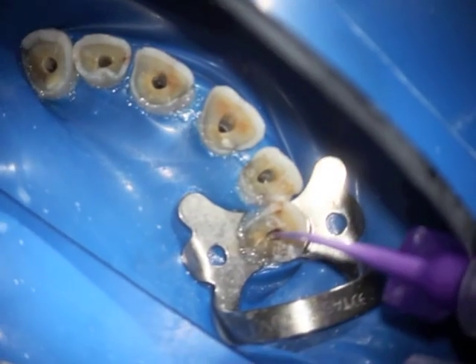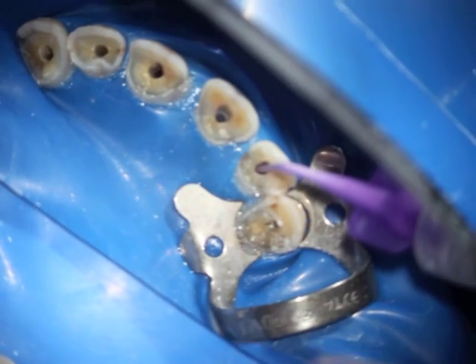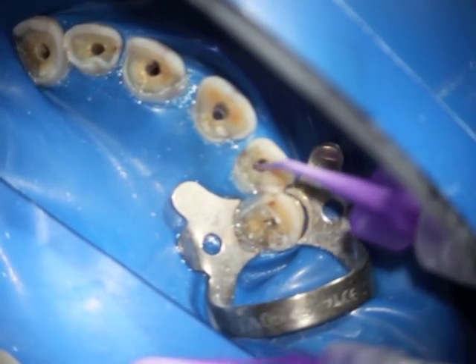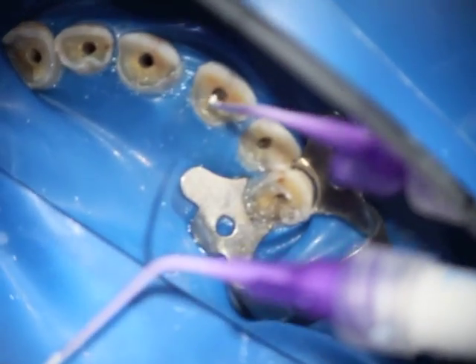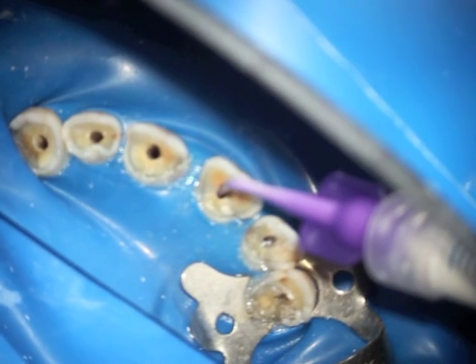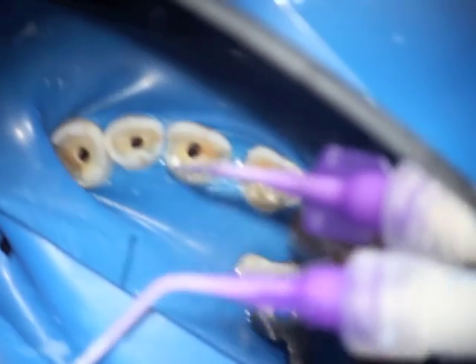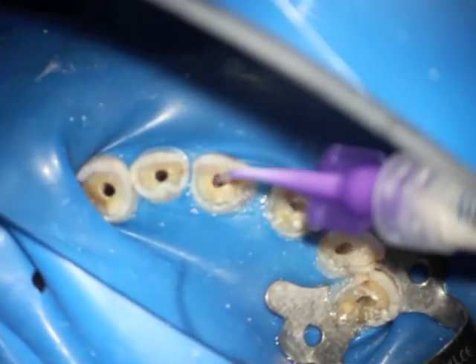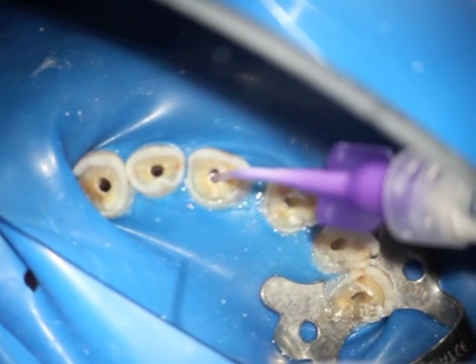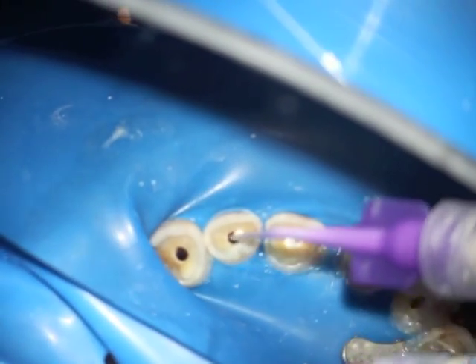I'm now injecting the EndoSequence bioceramic sealer inside each canal after preparation, irrigation, and drying. This injection technique is a very efficient way of placing the sealer in the canal. It does require some experience so that the right amount of sealer is actually placed in the canal.